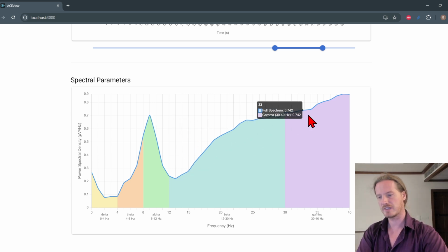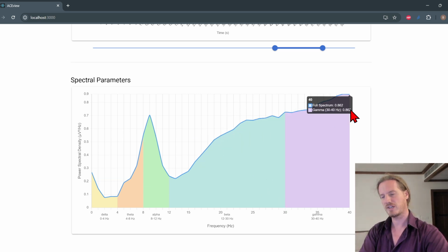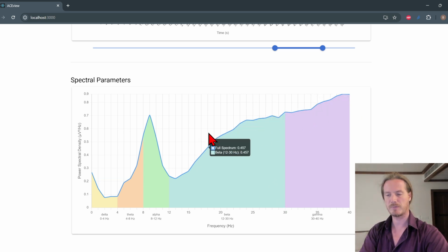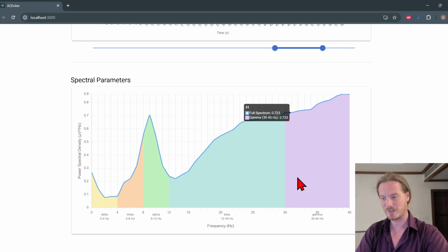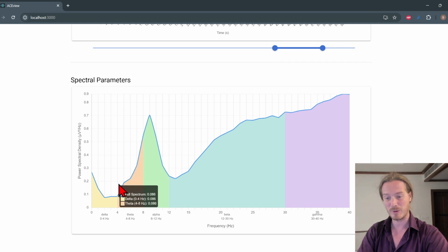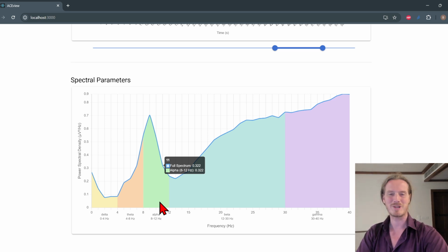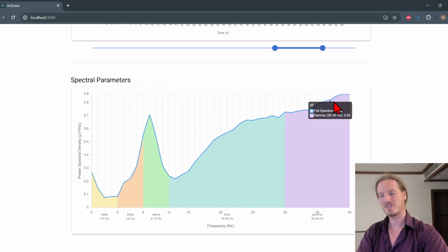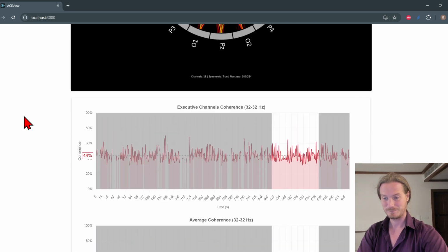And we can see here that, once you've seen a few of these charts, then you know what sort of the curve is. So we don't see any specific bumps sticking out, but sometimes there might be a big bump over here, indicating still a lot of thoughts going on in the beta range or in the gamma range. Or if we see a bigger bump over here, and we kind of see a bump over here at 5 hertz, then that indicates some sleepiness. So this chart with a little bit of practice can actually tell us a lot of what is happening in the person while they are sitting there.